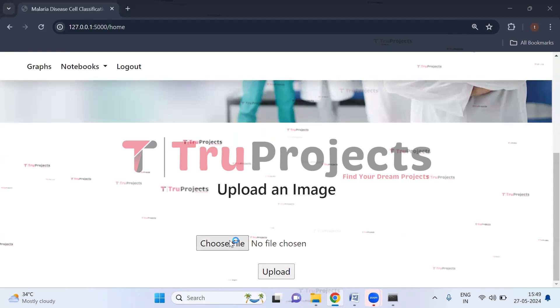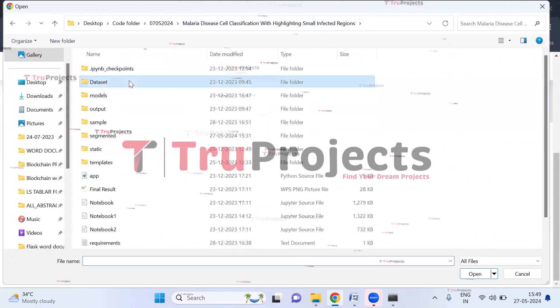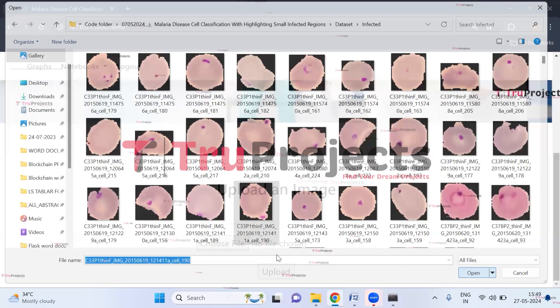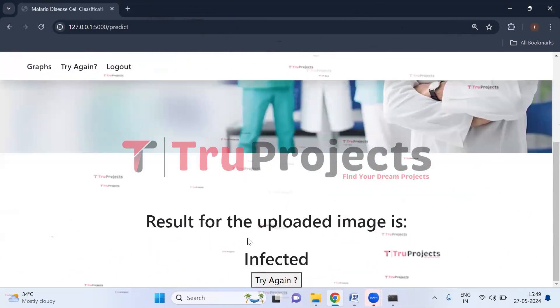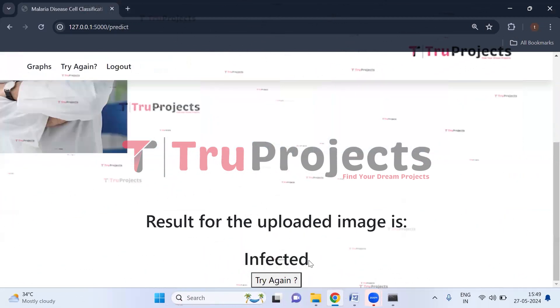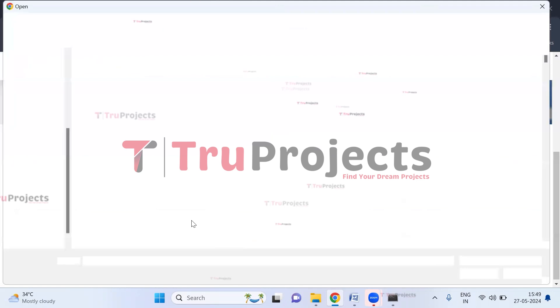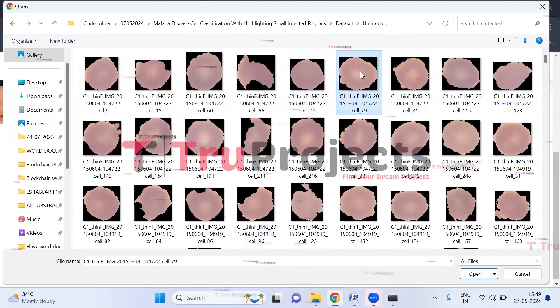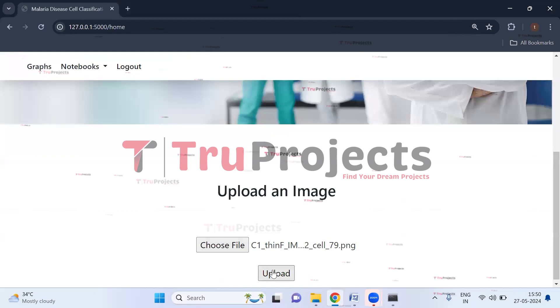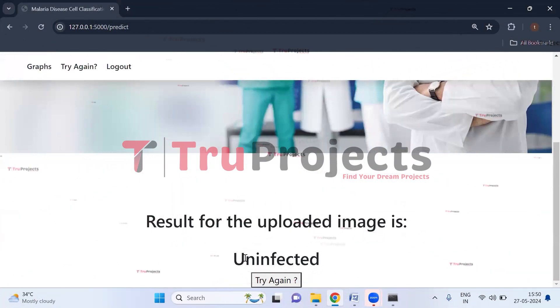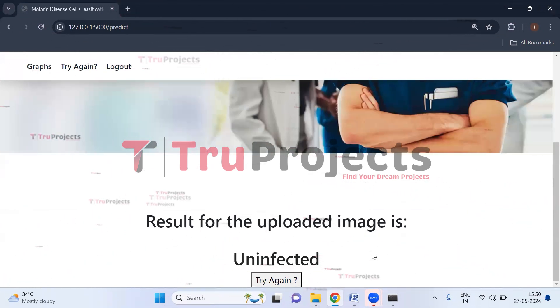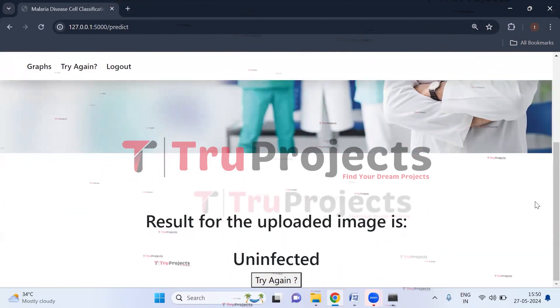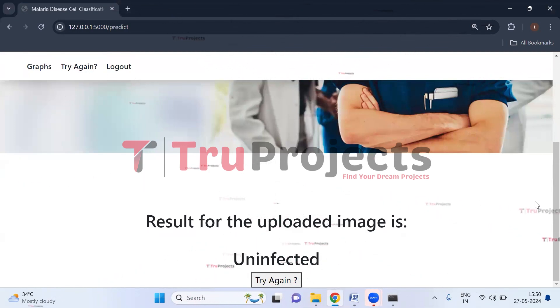Let us upload more images from the dataset's infected folder. Selecting an image and clicking Upload, the result shows 'infected.' In this way, just by uploading images we can predict whether the person is infected with malaria or not.